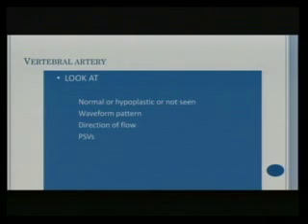Sometimes that aberration in caliber of the right and the left vertebral artery is not available to us on color Doppler. It's just not available to us because of the artifact of overbleeding. You don't see any vascularity, so the technologist turns up the color gain. When she turns up the color gain, there is the bleeding artifact.